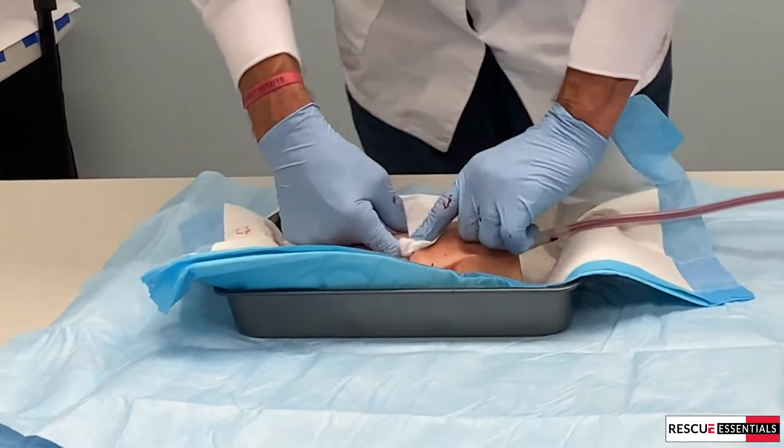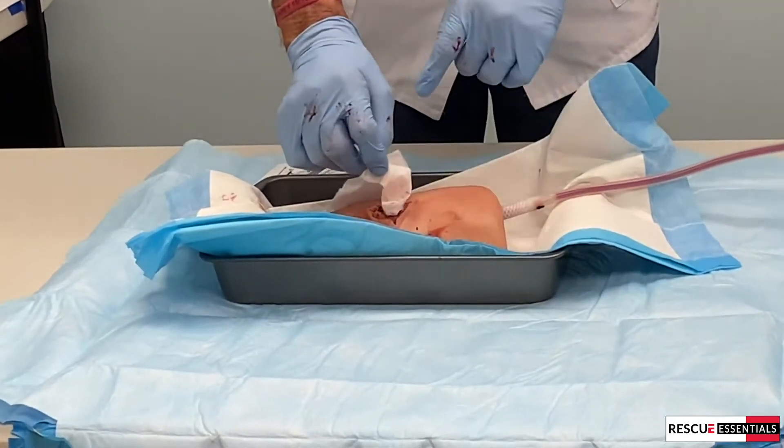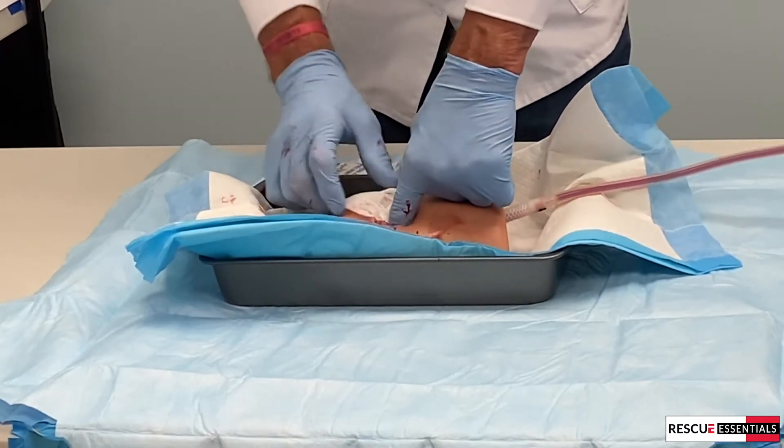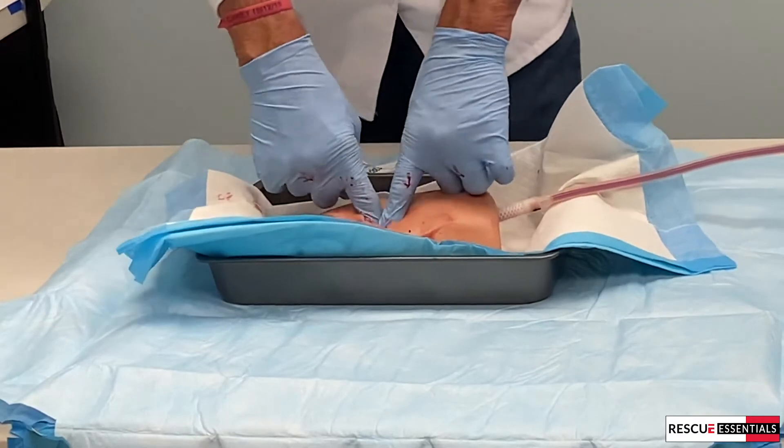Finger over finger. If I pull this finger out and get this one, then my bleeder is going to occur again. So I want to make sure I hold pressure before I push the next one in and do that exchange.